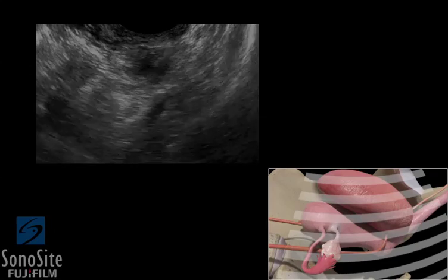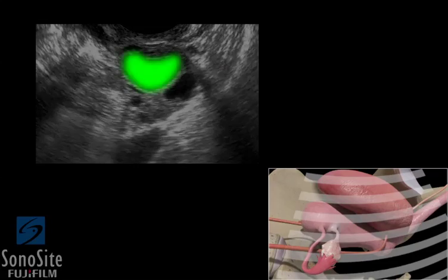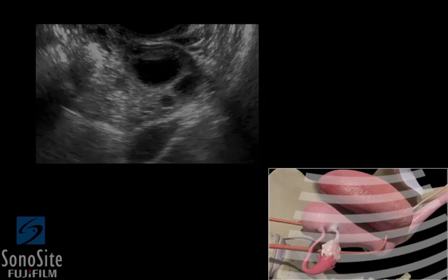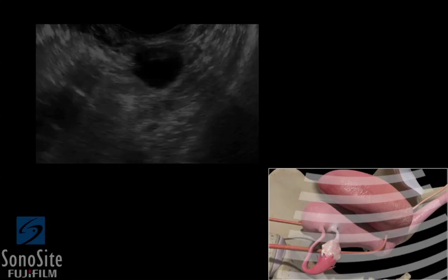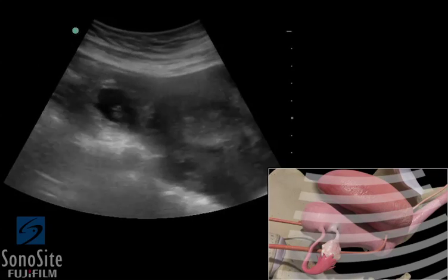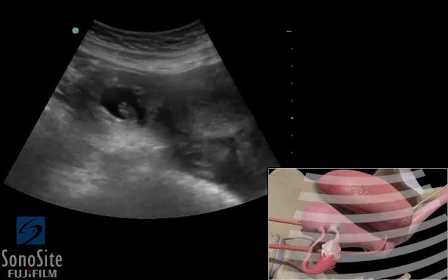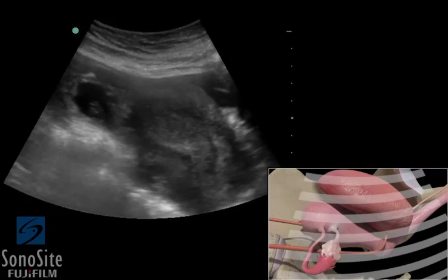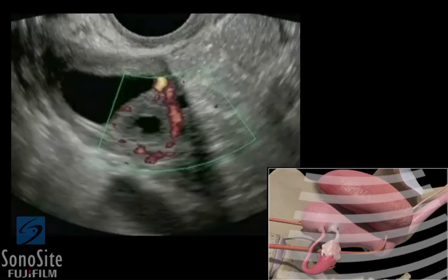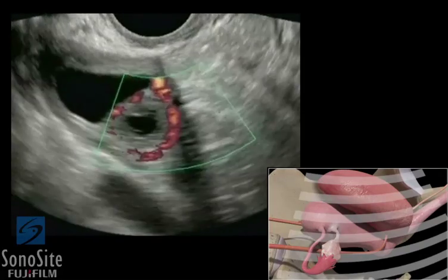After ovulation, a ruptured follicle may develop into a corpus luteum cyst, which will appear as a large anechoic round structure within the ovary and may persist for up to 3 months. An ectopic pregnancy will appear as a complex echogenic structure and may contain identifiable embryonic structures, including a gestational sac or fetus. Doppler ultrasound may demonstrate a hypervascular ring of fire sign associated with ectopic pregnancy.